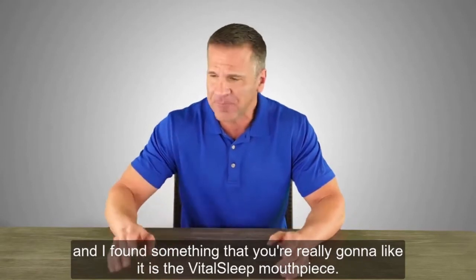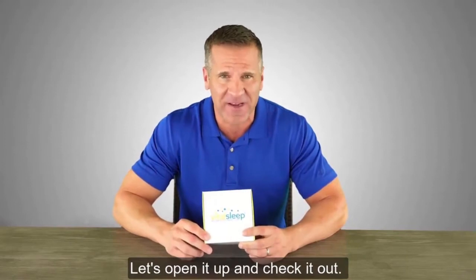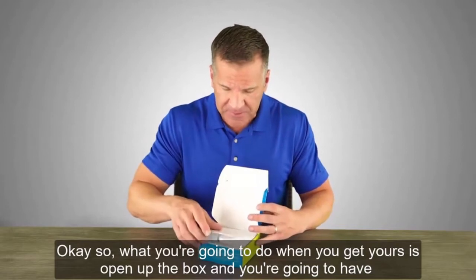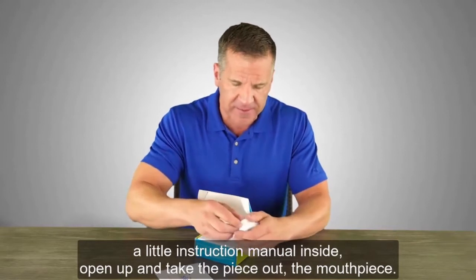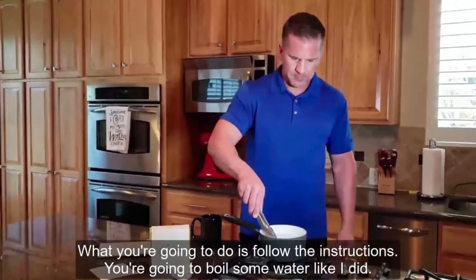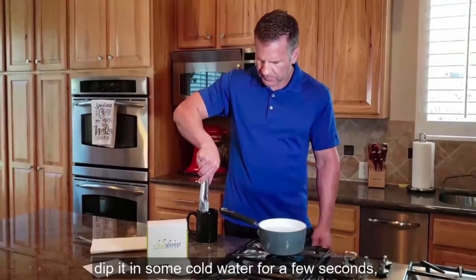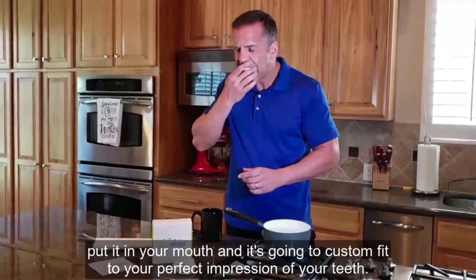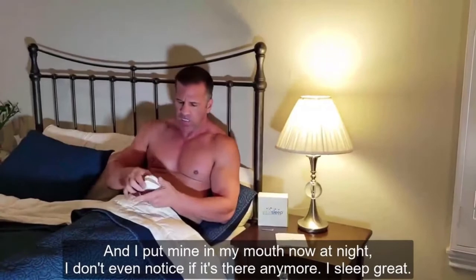We had to find a solution to help me solve my snoring problem, and I found something you're really going to like — it is the VitalSleep mouthpiece. Let's open it up and check it out. When you get yours, open up the box and you'll have a little instruction manual inside. Take the mouthpiece out and follow the instructions: boil some water for the allotted time, take it out of the water, dip it in cold water for a few seconds, put it in your mouth, and it will custom fit to the perfect impression of your teeth.